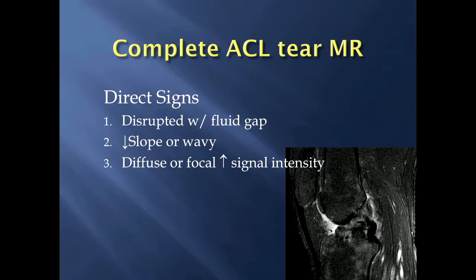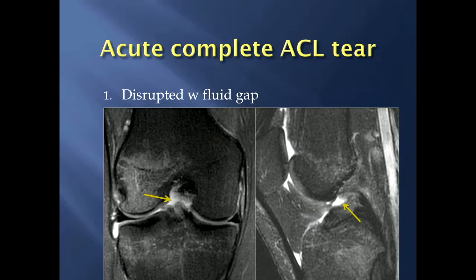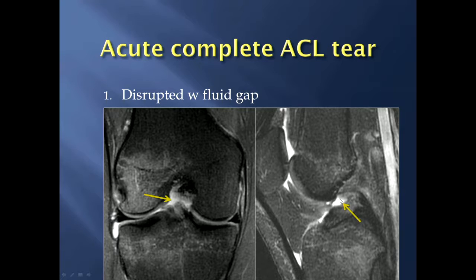Starting with a complete ACL tear, there are three direct signs on MRI. The first indication is if the entire ACL is disrupted with a fluid gap within it. Notice on this coronal image you have fluid signal, and on this sagittal image, looking from the tibial attachment of the ACL upward, it should have a taut appearance going straight up to its attachment site — you've got this fluid gap here indicating a complete ACL tear.